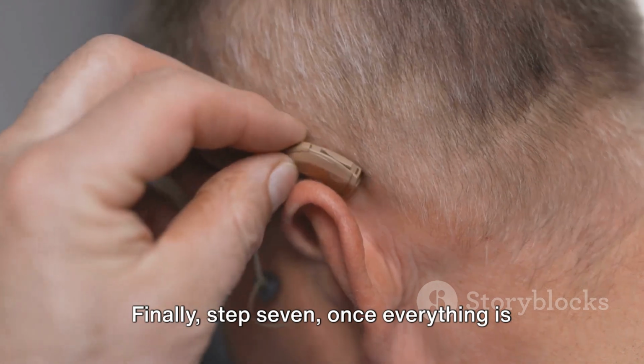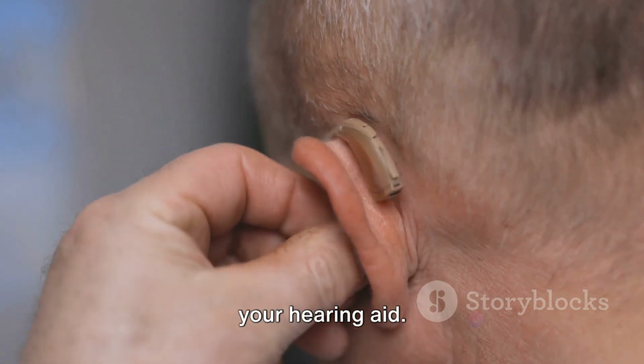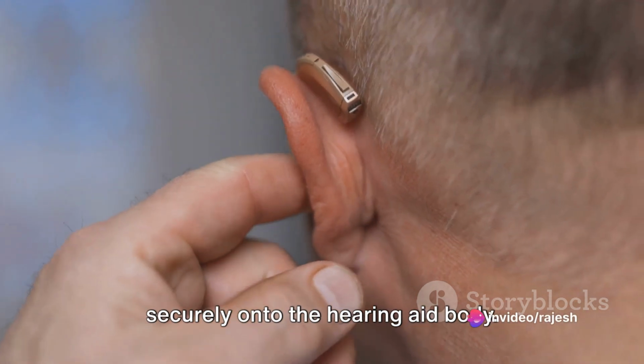Finally, step 7, once everything is clean and dry, it's time to reassemble your hearing aid. Replace the ear mold and ensure it fits securely onto the hearing aid body.